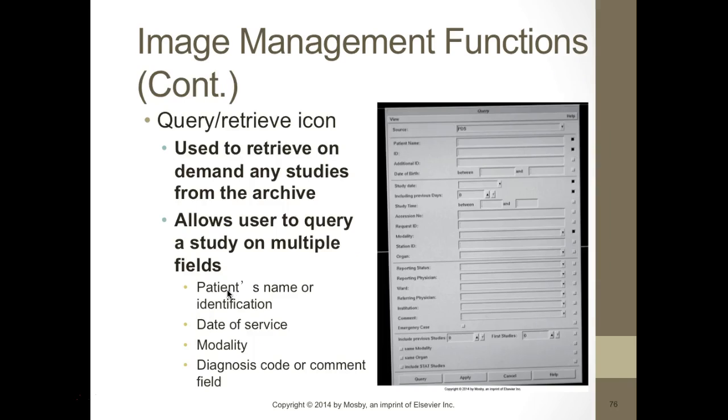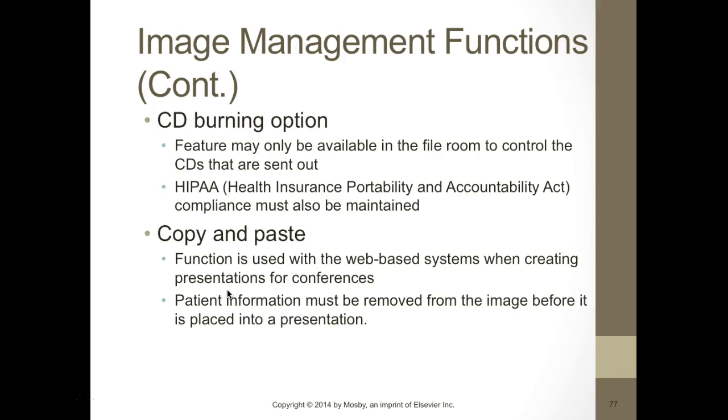So there's also the query or retrieve icon. You can put in the patient's last name or their ID number or their date of birth, and it'll actually find the patient for you, which is great.